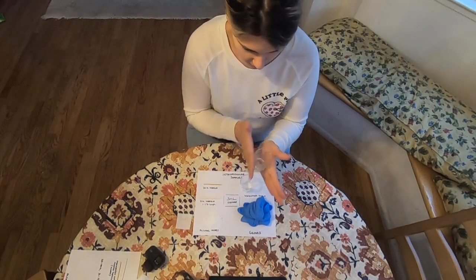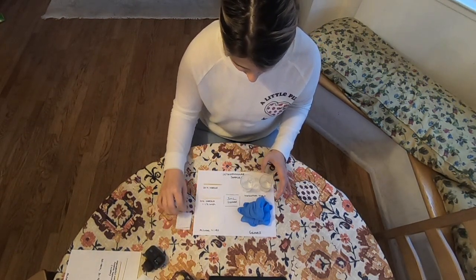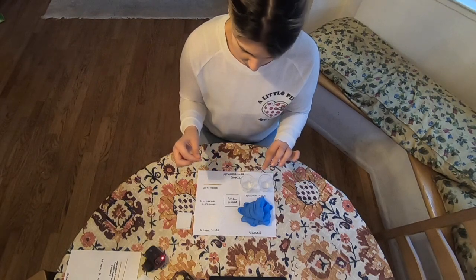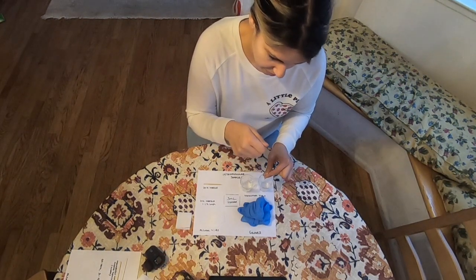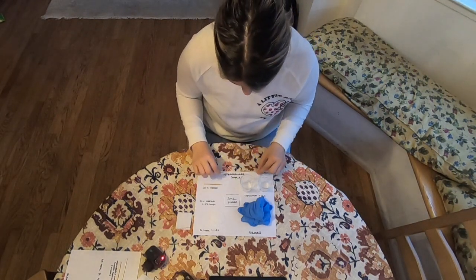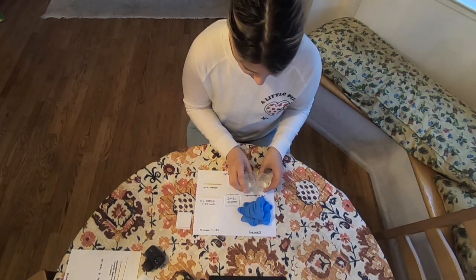Once the medication is fully mixed, take another alcohol wipe and cleanse the top again. Attach the new administration needle to the syringe, inject air in, and draw up 1ml by pulling back on the barrel of the syringe. Check for air bubbles and remove them. Recap the needle safely — not with your hands, push against something. Set the prepared syringe aside and dispose of the two vials into the sharps container.